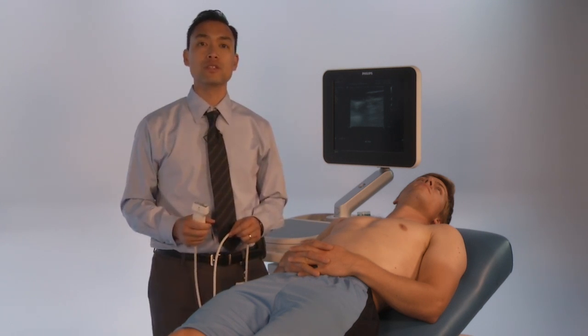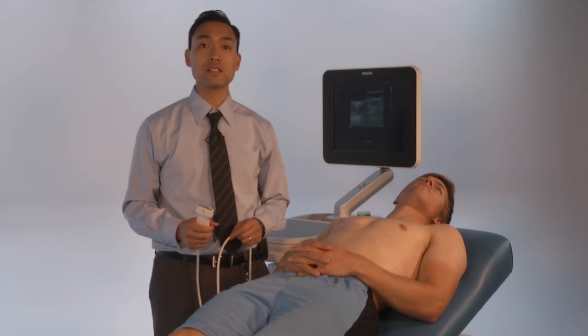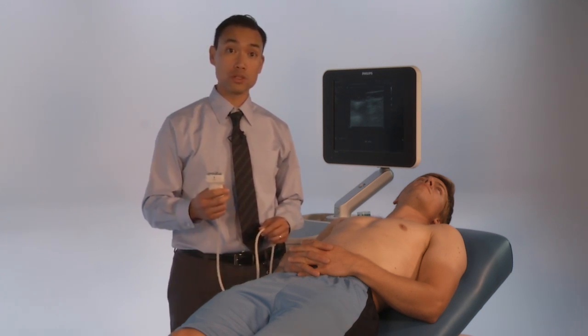In this video we're going to use ultrasound to assess the neck vessels and assess for jugular venous pulsation with the ultrasound.